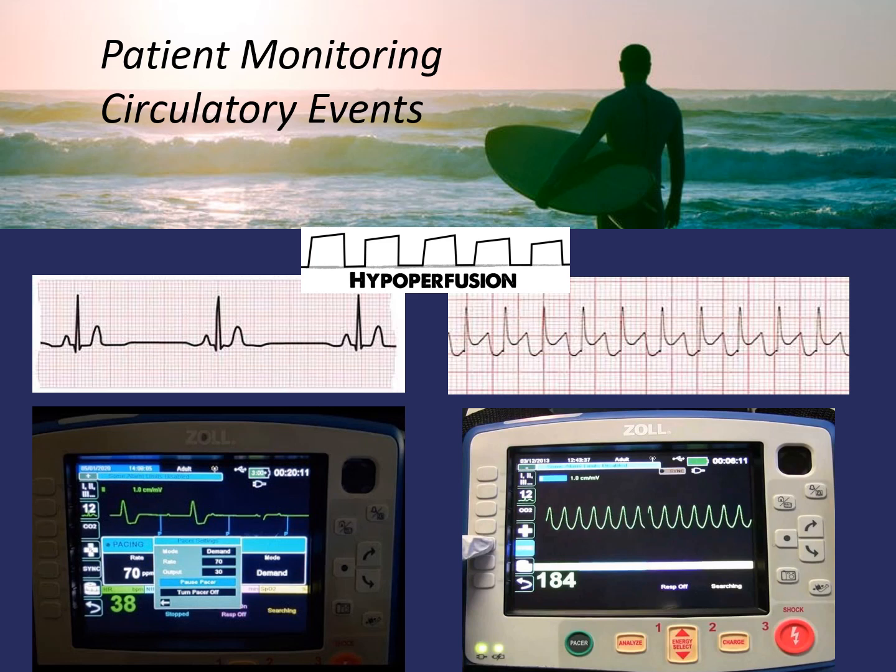While you are monitoring a tachycardic patient that seems to be compensating, you observe a normal end-tidal CO2 with adequate vitals. If this patient begins to decompensate, a continuous monitoring of end-tidal CO2 can alert you to the lack of compensation much faster than obtaining blood pressures or other signs of decreased perfusion. In this case, you would see a drop in the end-tidal CO2, a drop in the waveform amplitude as the patient's perfusion decreases. For circulatory issues, you want to see the end-tidal CO2 increasing or trending in the higher direction as you apply your treatments.